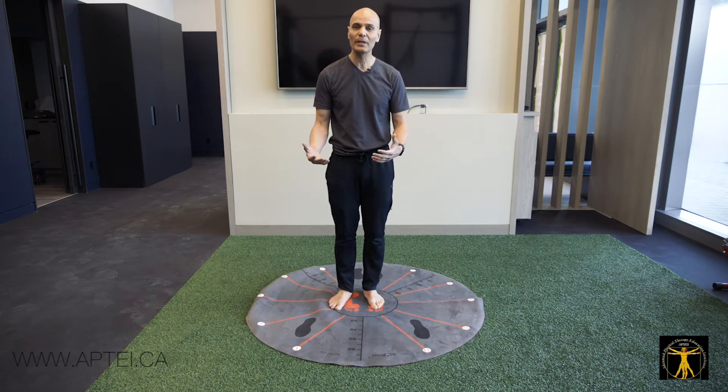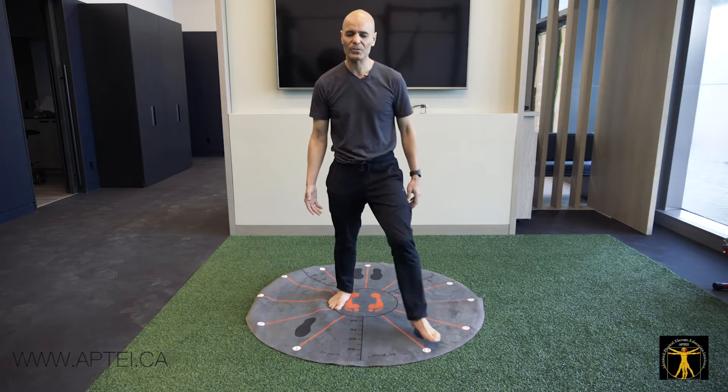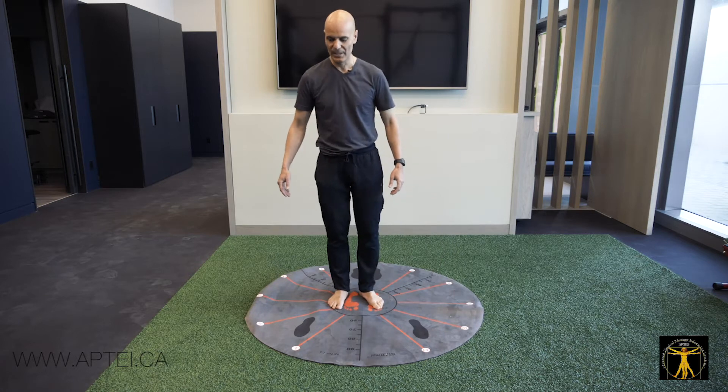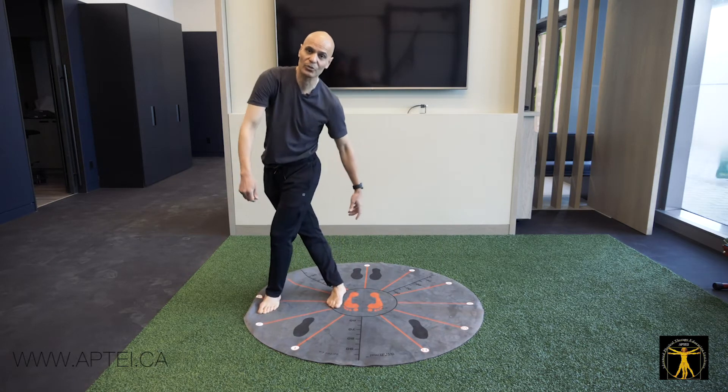You do it once with eyes open and once with eyes closed. Once with the right leg and once with the left leg. Always go through the whole clock pattern, especially the 9 o'clock pattern where you're crisscrossing.